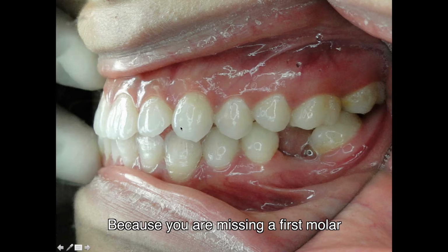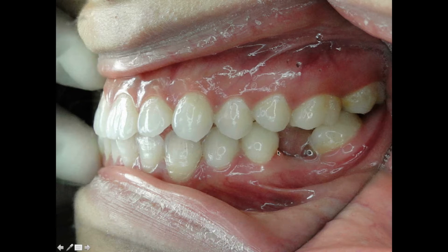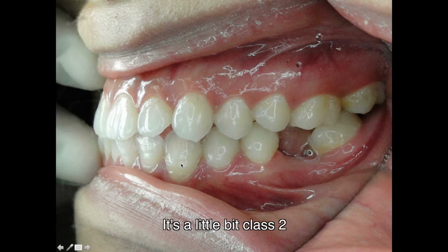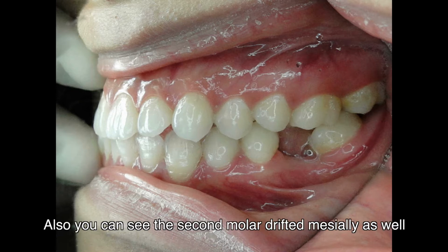Why? Because you're missing a first molar. The second bicuspid, and then the first bicuspid, and then the canine will drift distally as you're missing these two, because nothing stops these teeth from going backward. This is a natural phenomenon. Therefore, you can see the canine is not in the ideal class 1 situation. It's a little bit class 2 because of the falling back of the first bicuspid and then the second bicuspid. And also you can see the second molar drifted mesially as well.